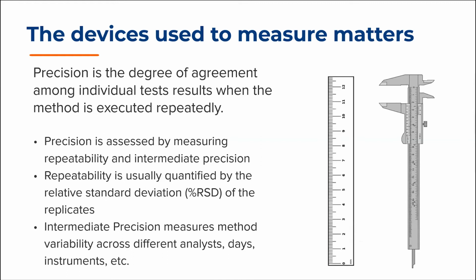Having established accuracy, now we can shift our discussion to precision. To get an intuitive feel of what precision is, we take these two instruments used to measure length. They both measure length with roughly the same accuracy. However, the calipers have been designed to perform measurements in a more repeatable manner. The use of the armatures to clamp to the object being measured in conjunction with the crosshatching used to read out the measurement leads to a significant improvement in the instrument's ability to repeatedly measure distance relative to the ruler.